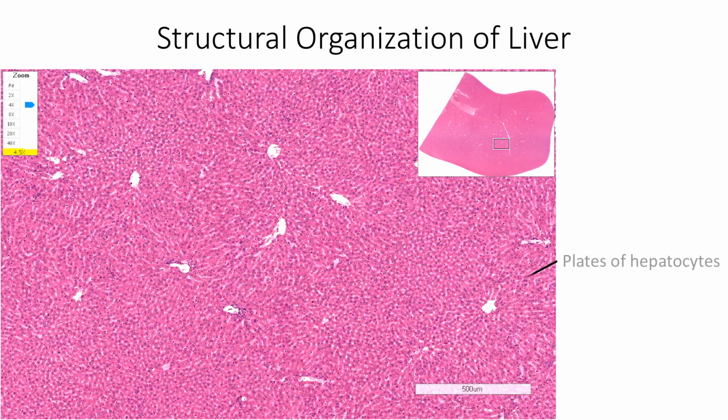Liver parenchyma consists of plates of hepatocytes that appear to be radiating from the central vein. These plates of hepatocytes are usually 1 cell thick in case of adults. When we see more than 2 cell thickness in adults, it indicates either regeneration of hepatocytes or malignant changes.